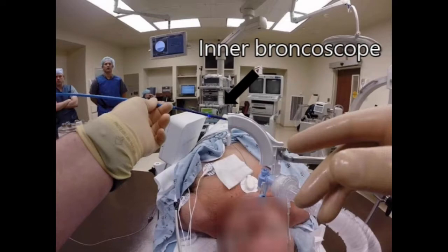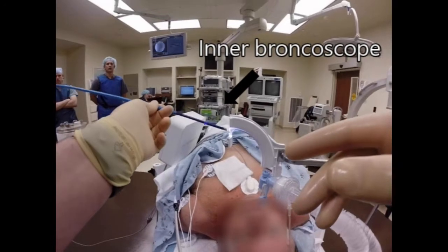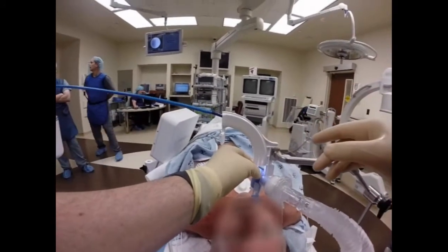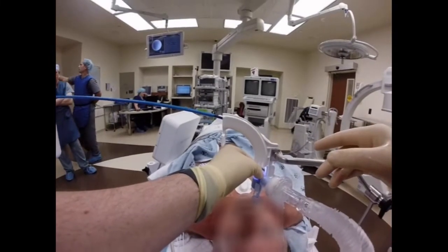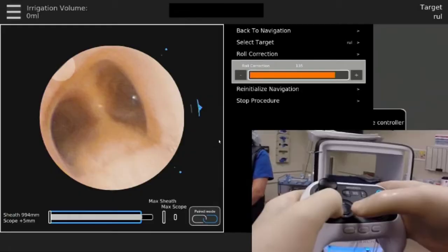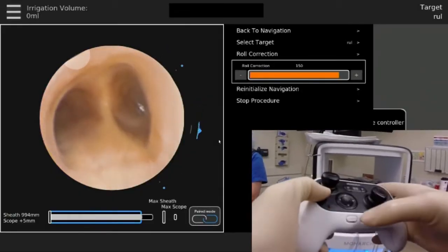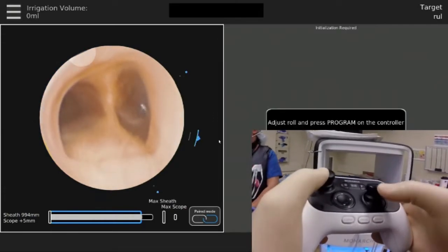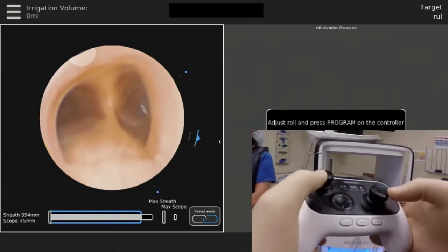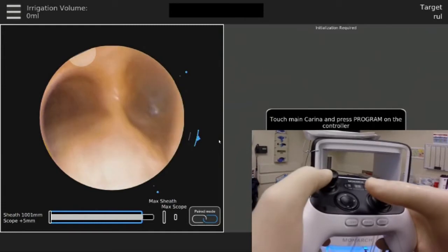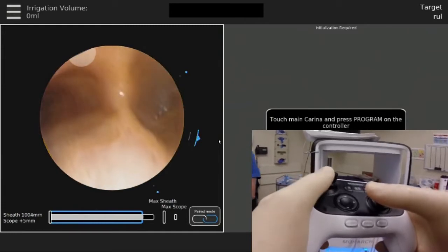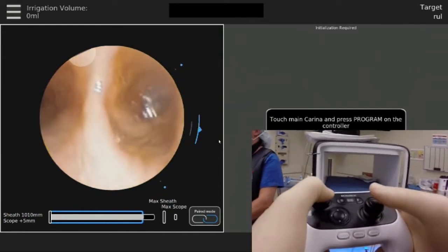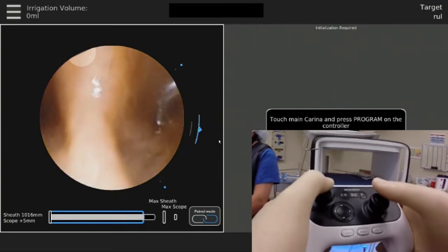The inner bronchoscope is passed through the endotracheal tube holder into the endotracheal tube. The beginning of the procedure involves initialization, which is the process of matching the virtual anatomy with the patient's own anatomy.